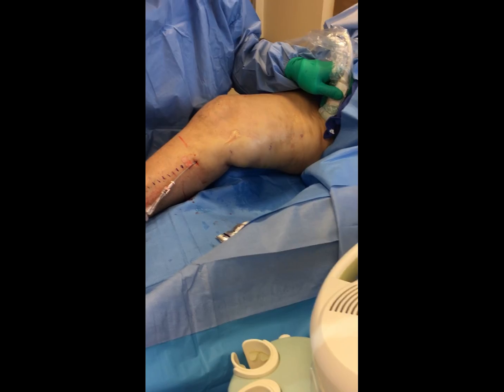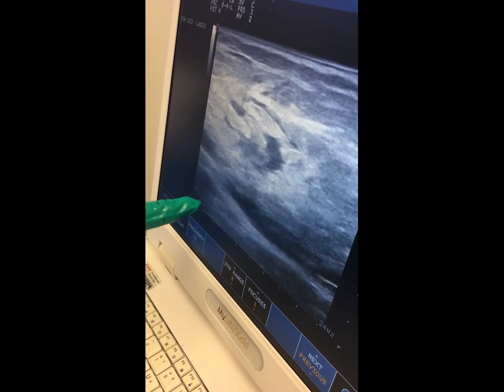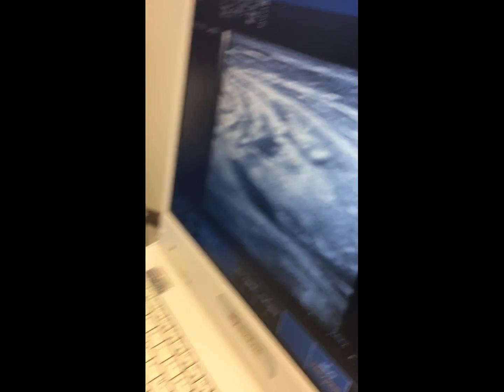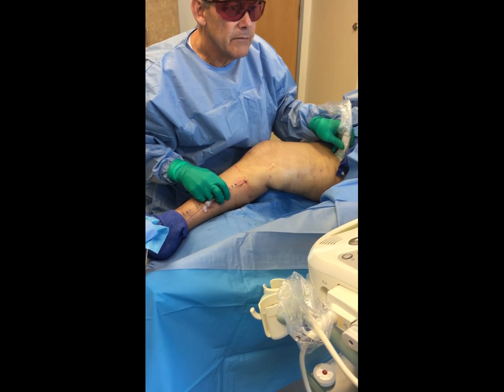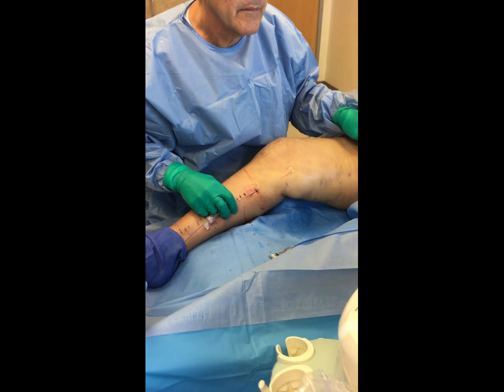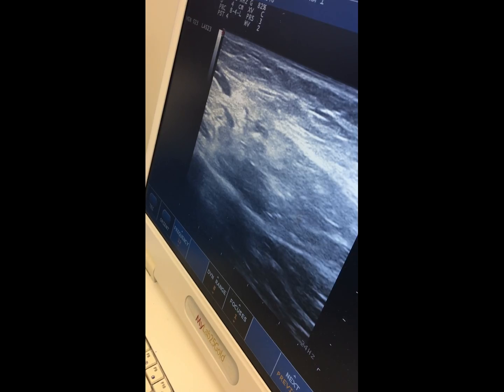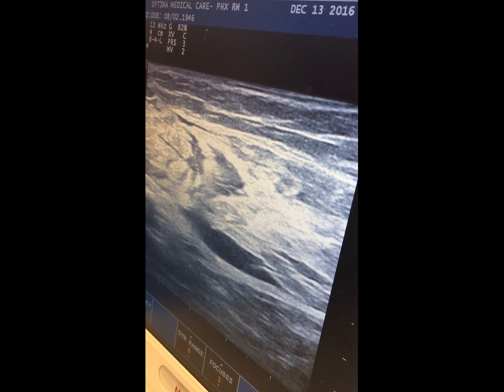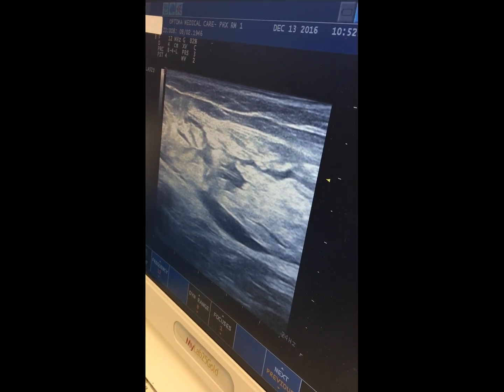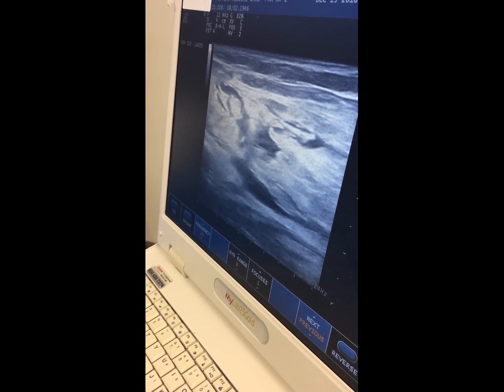We're back to recording — we're at 10:47. Her laser fiber is right here on the screen; you can see that little round circle, and it ends right there at her junction. What we're going to do now is test to make sure she's nice and numb. On the screen when we start you'll see a bubbling aspect — that's where the laser fiber is situated. Now I'm basically going to bring this down. You can see the tip of the laser fiber; I can follow it if I want.